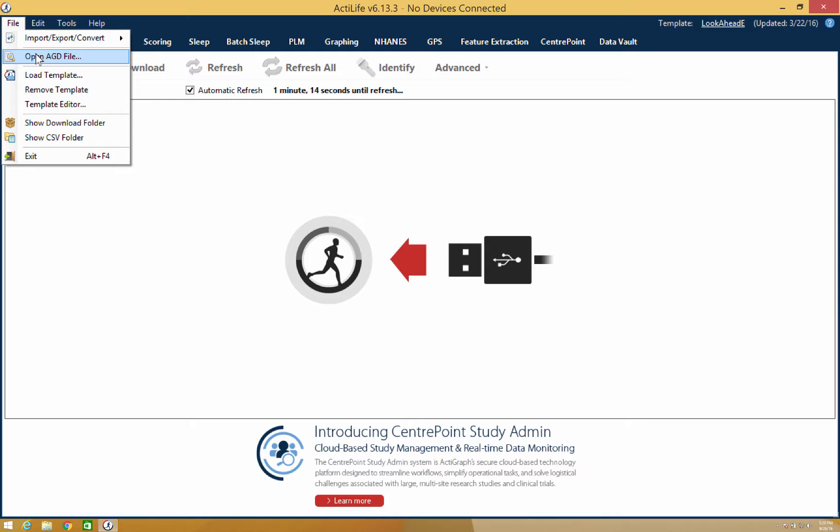Within ActiLife, you can also create and edit templates to be used in your study. Templates help eliminate some of the human errors that can occur in data collection and make sure that all of your devices are initialized and data is retrieved in the same manner.